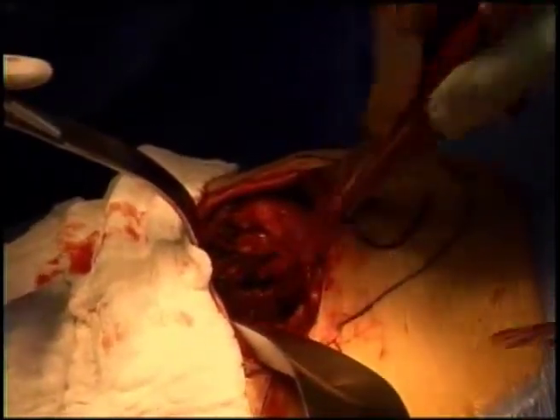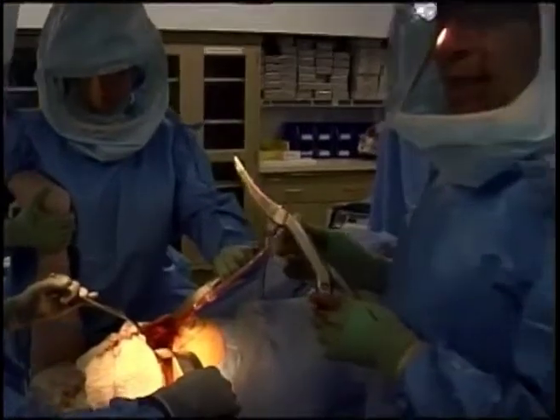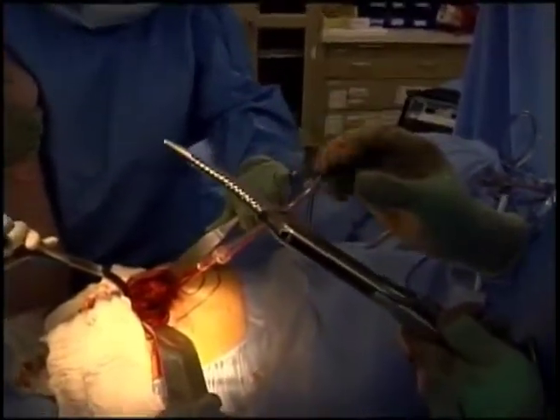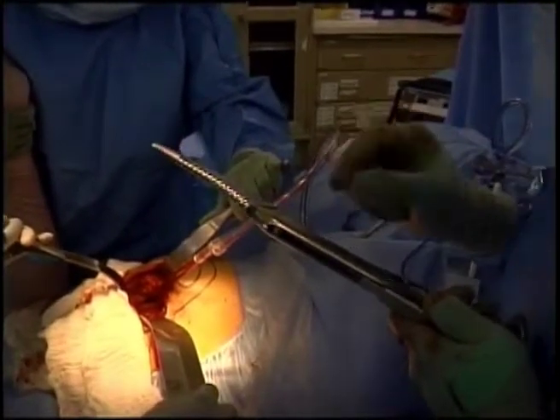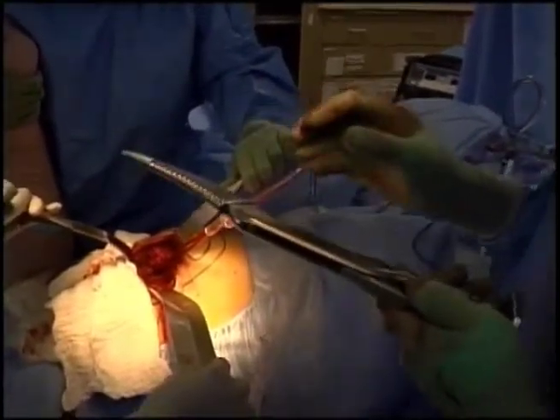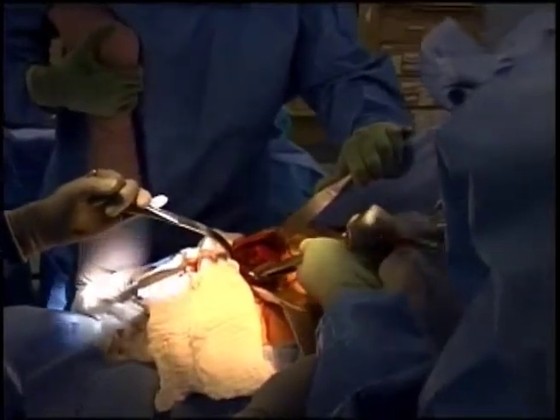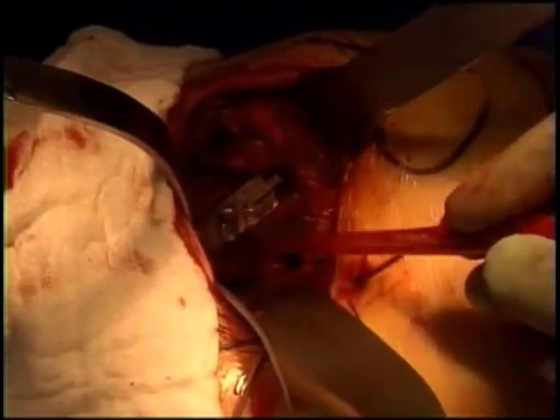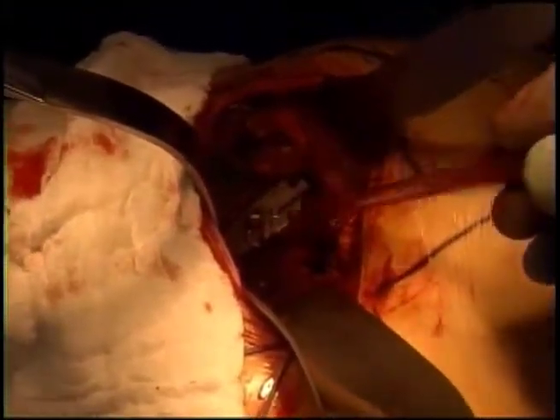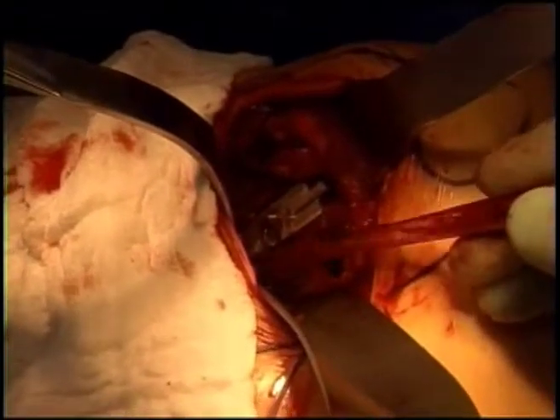This is a broach — a cutting instrument shaped the same as the implant that will go into the thigh bone. It cuts and impacts the bone to shape the interior to the exact size and shape of the implant. It's impacted using a hammer. These broaches sequentially increase in size until we find one that fits the full width of the patient's bone, so it will be stable and won't move. You can see this broach trial fits firmly from the outside all the way to the inside of the patient's thigh bone.